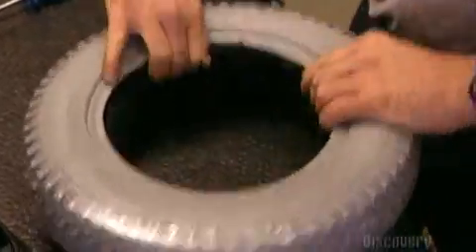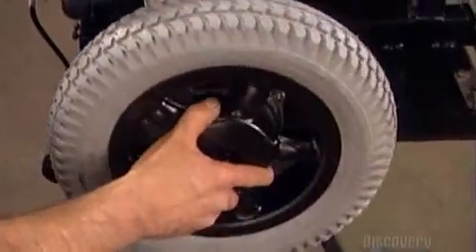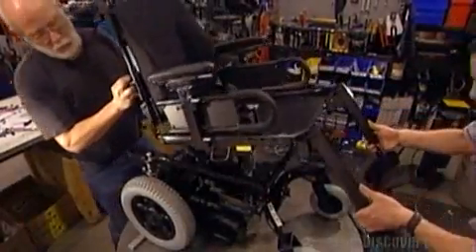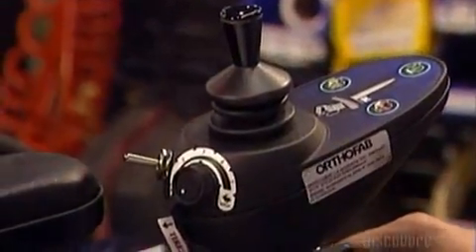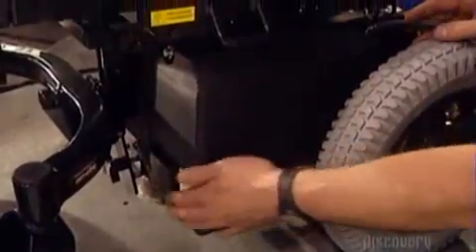Workers squeeze the inner tube into the rear wheel rim. The air valve slips through and the front and back parts attach with screws. Now the rear wheel can go onto the motor. They attach the seat and the joystick box, which has on-off and speed control switches. The battery pack provides 85 amps an hour. That's enough power for 16 hours or 40 kilometers.